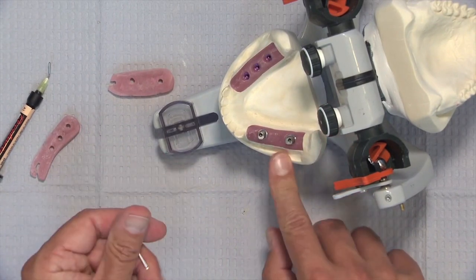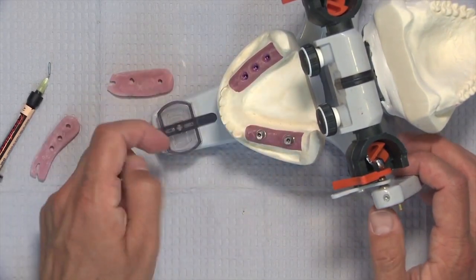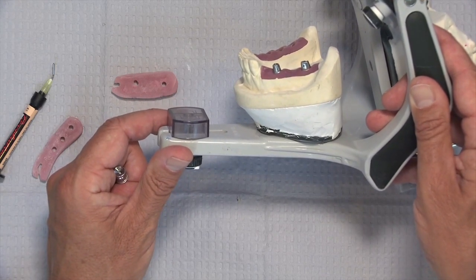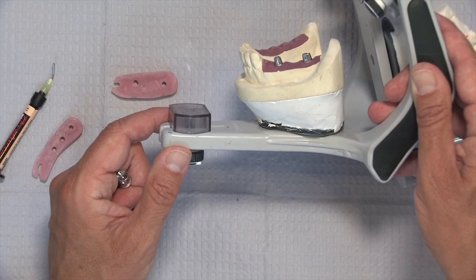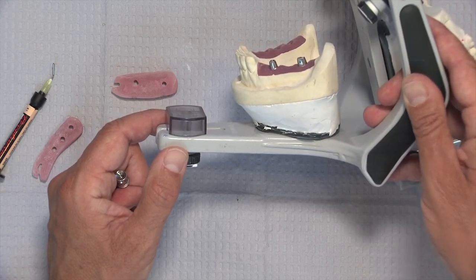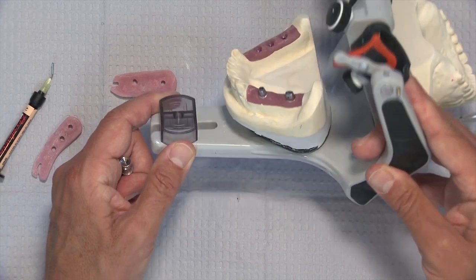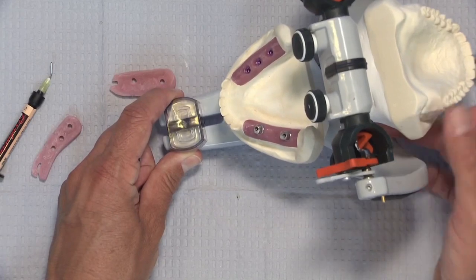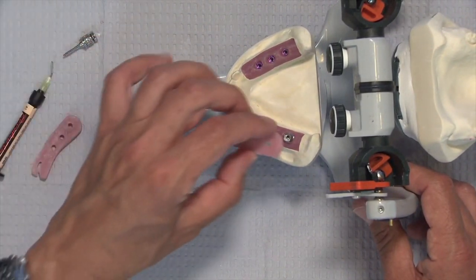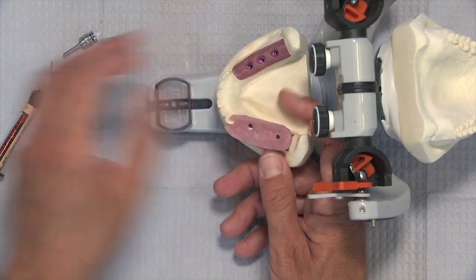We remove the index and flick off the two little pieces of flowable composite, then verify the screws are tightened. At this point we take a radiograph — and this is one of the great reasons to have digital radiography — to make sure the implant components are fully seated. A lot of times we're dealing with components that are three to five millimeters subgingival and you just can't check visually. You also can't assume that because the screw stopped turning that everything is seated, so digital radiographs are essential.